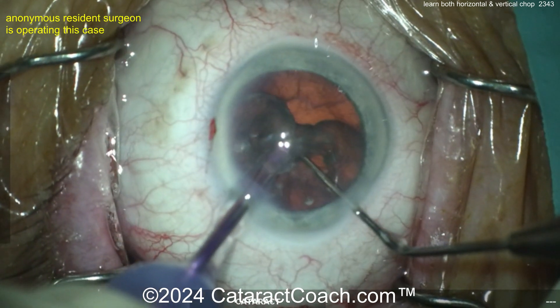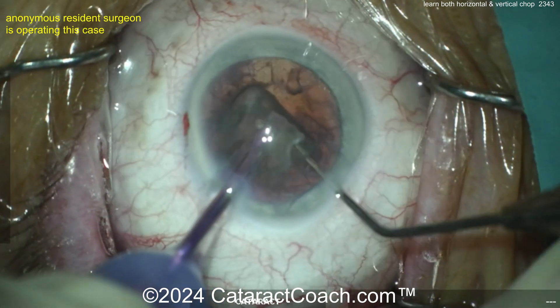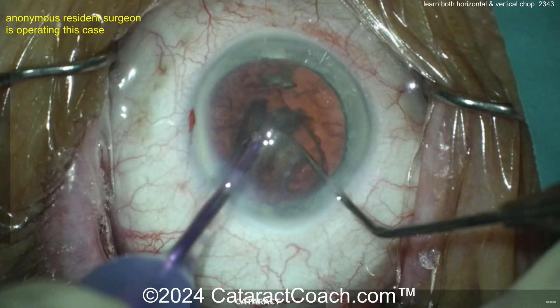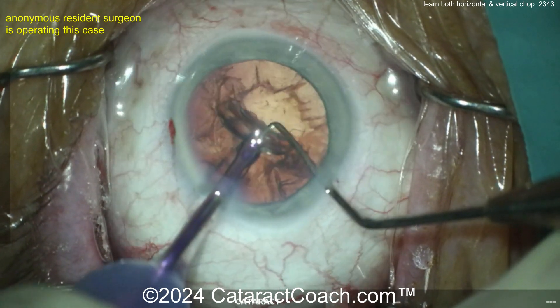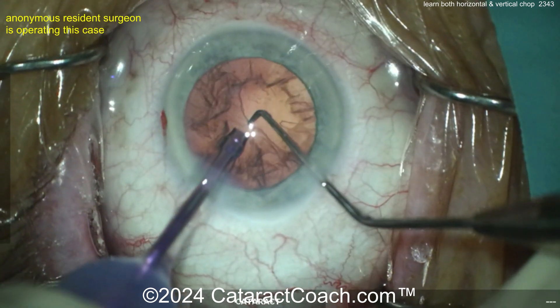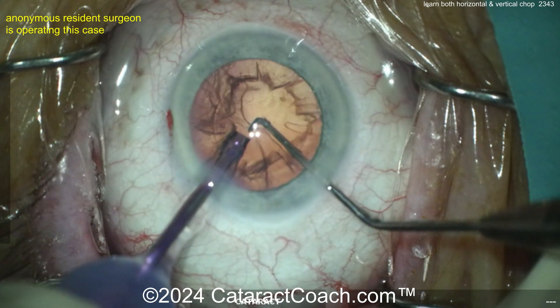Here's the epinuclear shell. In both these cases, the resident basically chopped the endonucleus and left the big epinuclear shell intact, then that's aspirated out at the end — a beautiful technique. So if this young resident did a great job, keep on learning and take the advice and instructions we've given here to become better. But if this young resident can learn the chop, I promise you can learn it too.